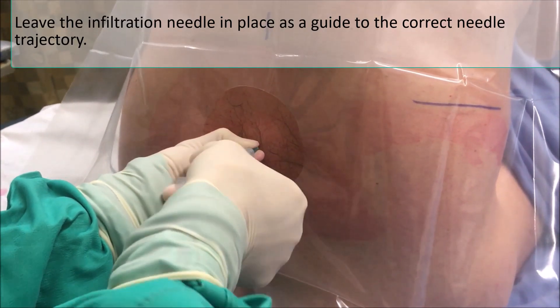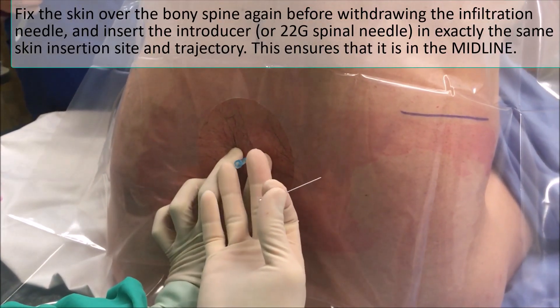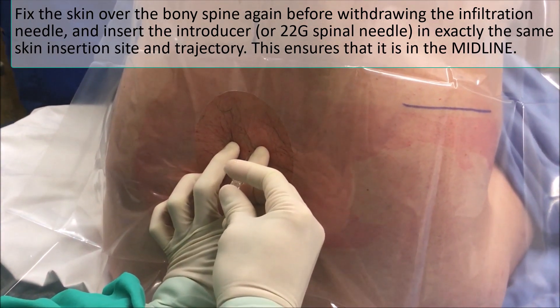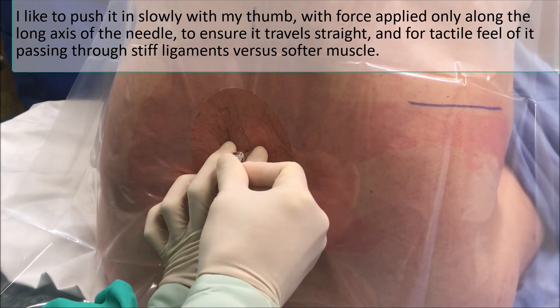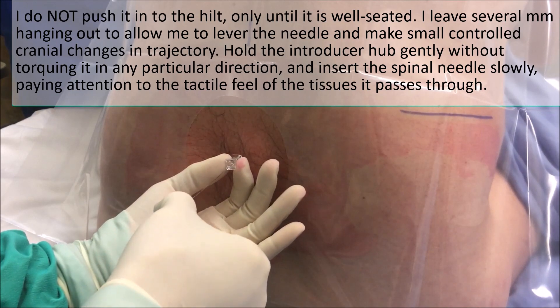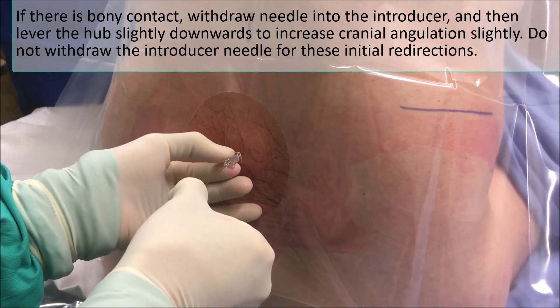Now I'm going to leave that needle there and fix the skin again. I pull this out and my other fingers keep the skin exactly where it should be. It should feel nice and fixed for the introducer — put this in. If I strike bone, just angle the needle drop slightly.